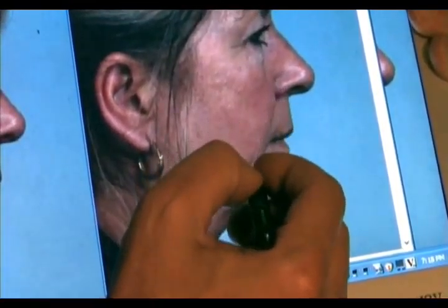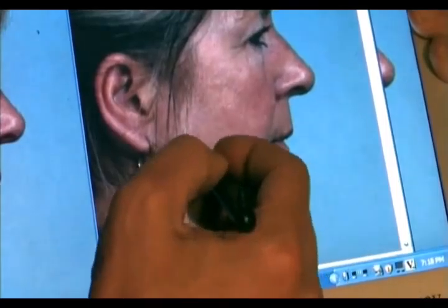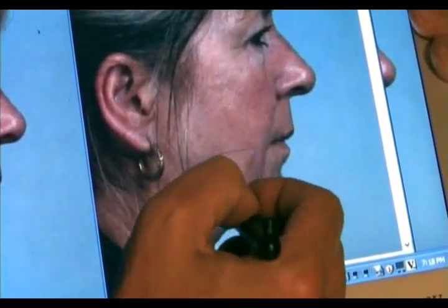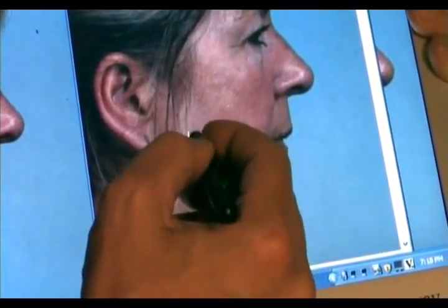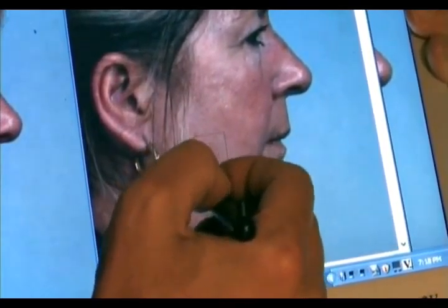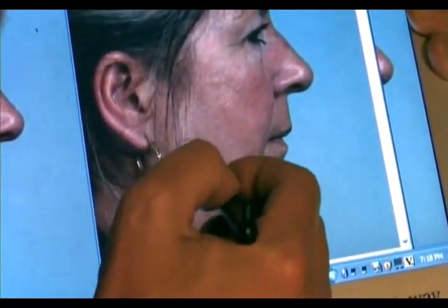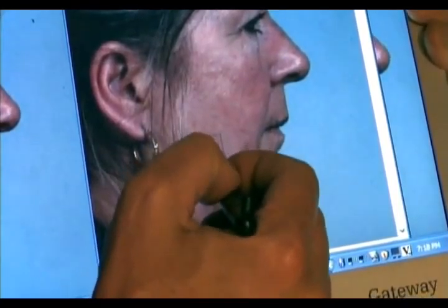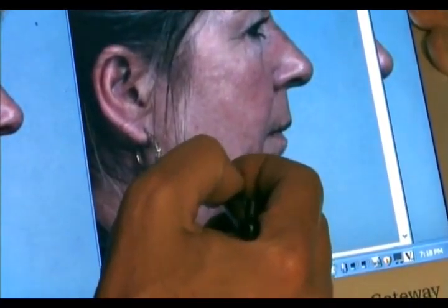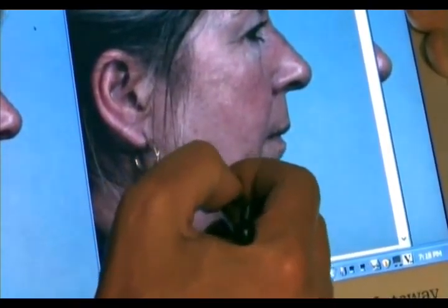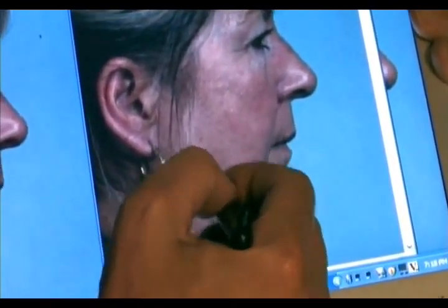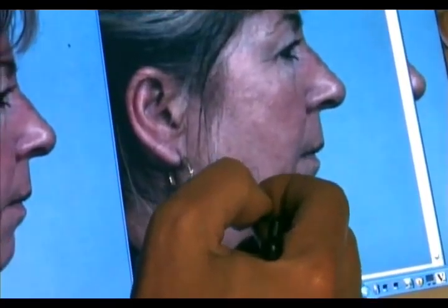These are the jowl areas and I can bring the jowl up. A more defined jawline or mandible angle is what is defined — that is consistent with youthfulness.